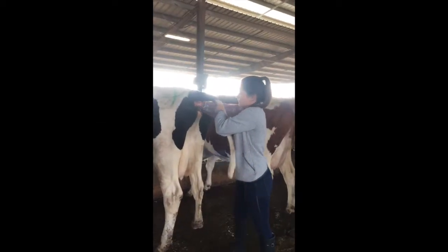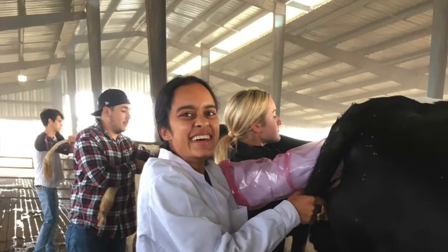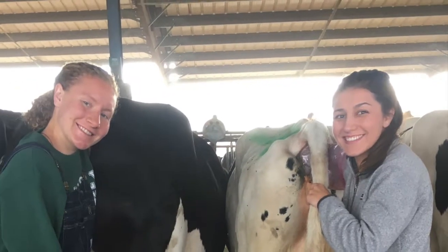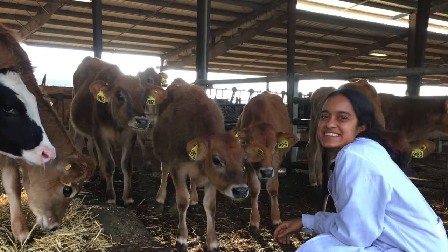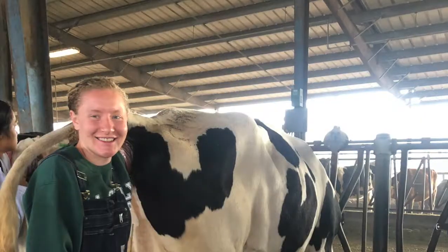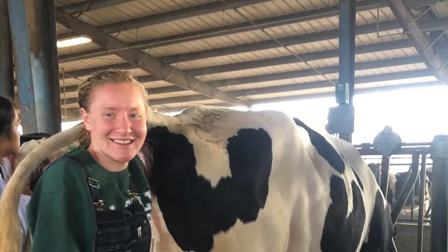In the palpation lab, we found and evaluated the major reproductive structures of the female bovine, including the cervix, uterine body, uterine horns, and ovaries. We used the pelvic ridge as a landmark to identify where the rest of the reproductive tract would be located.